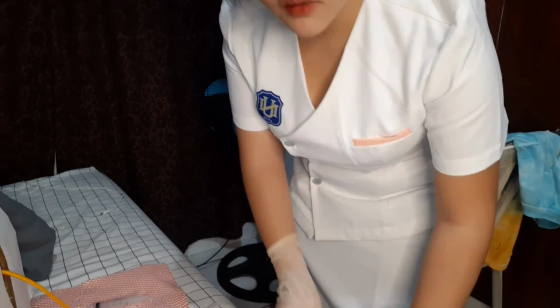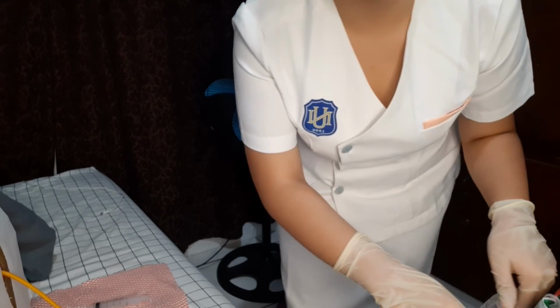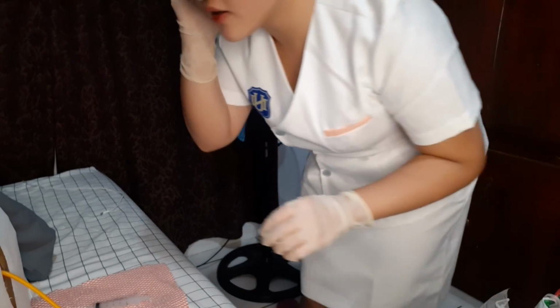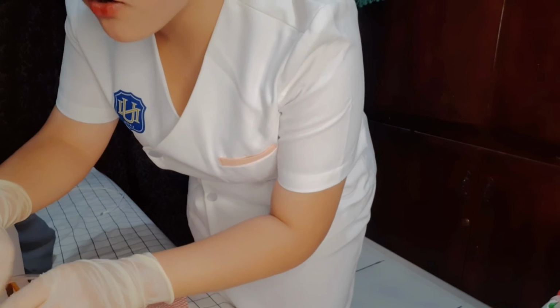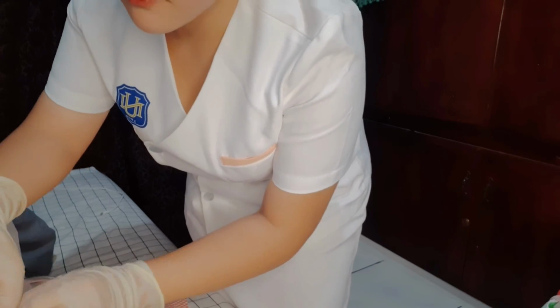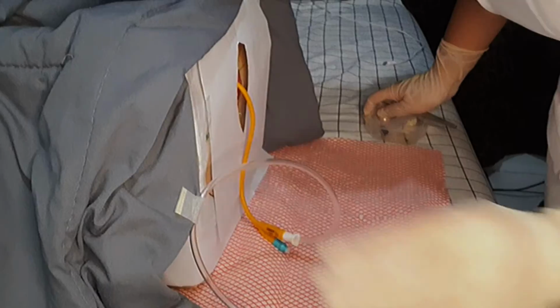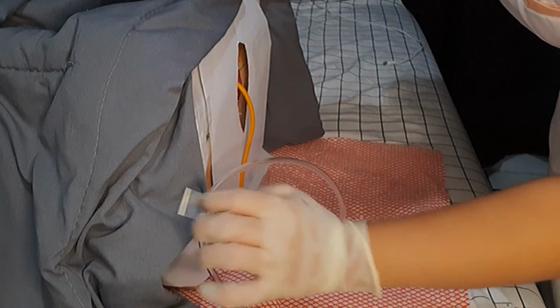So I will put the catheter bag or urine bag here. Imagine here. So I put the urine bag there. After putting the urine bag at the bedside of the patient, you need to attach the cord of the urine bag or the urinary catheterization to the thigh of the patient. Okay? So this is the imaginary or supposedly the thigh of the patient. So I put or attach the cord here.